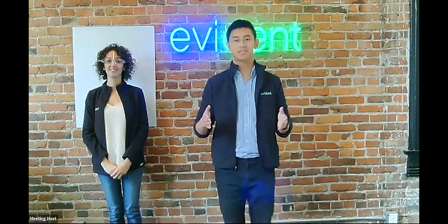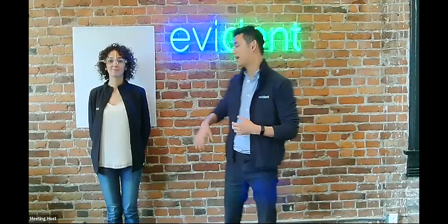So one of the questions that you guys ask is, for example, if you're wearing the facial reference glasses and you're taking multiple photos, is it really necessary for them to stay perfectly still and for you to take the photos from the exact same position? That's an excellent question. So a quick tip that we've been told too is if you lean back against the wall or have the patient lean back against the wall, that helps them keep perfectly still.